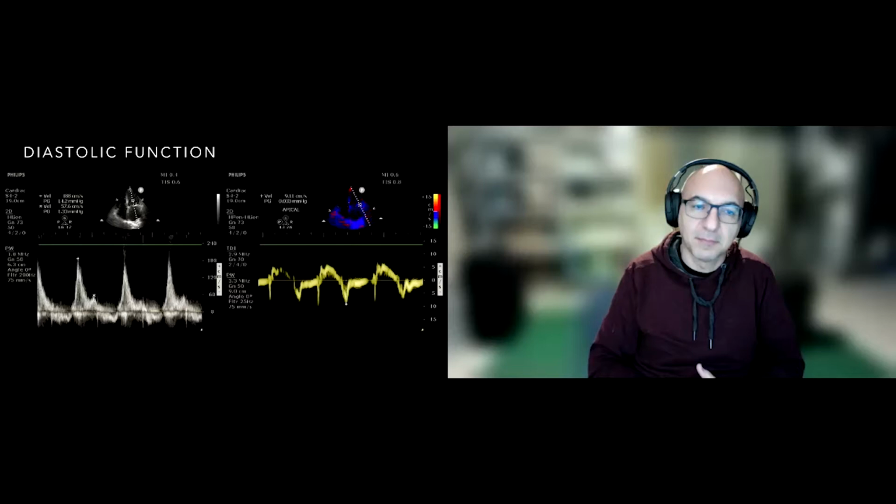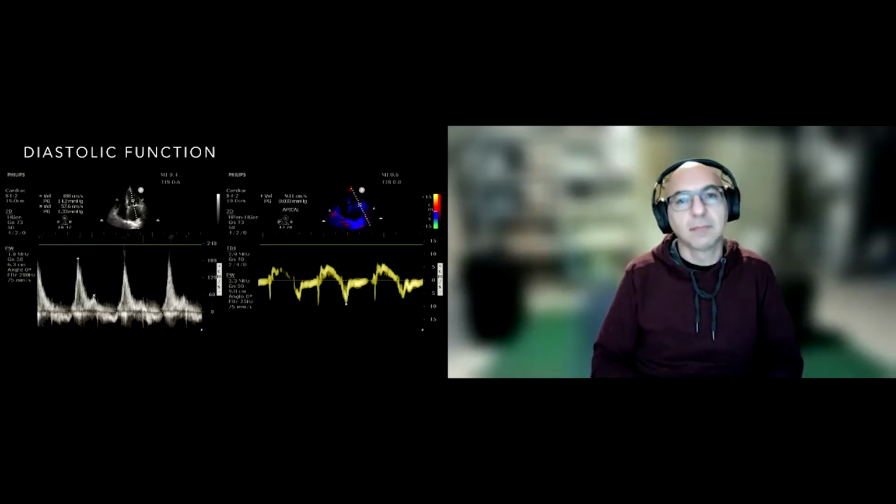So you can have a pump fail for a number of reasons. One of the reasons is it just doesn't pump, right? You just don't get flow out of it. And that's kind of what we talked about with the LV function, systolic function. The other reason for it to fail is the mechanics of it just don't work as smoothly as they need to, right? And in our situation, where we have a very, I guess, binary functioning heart, right? In that it's like an in, out, squeeze, relax type of a function.